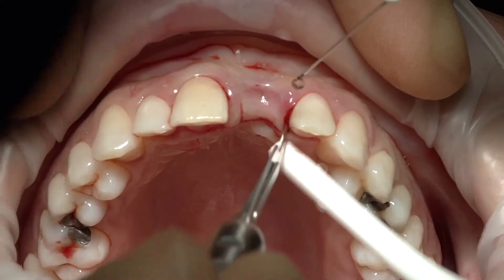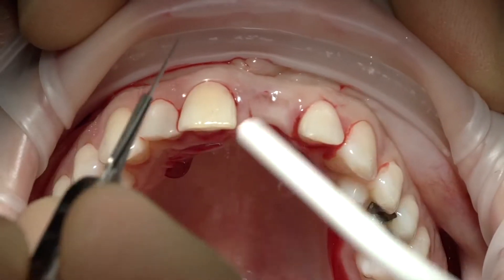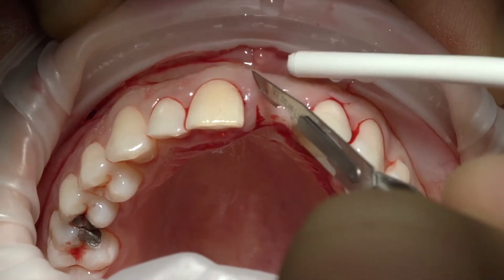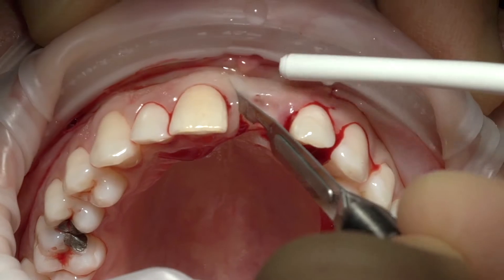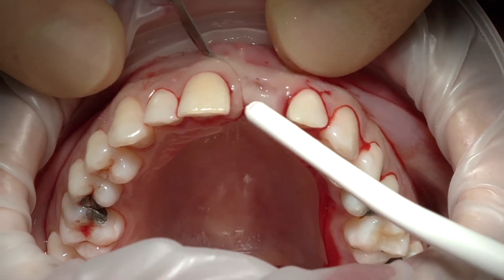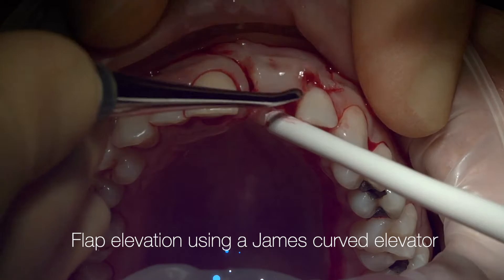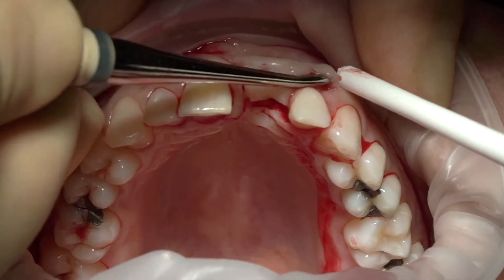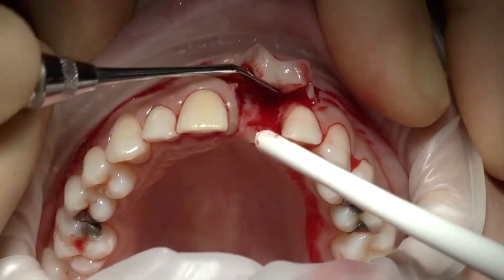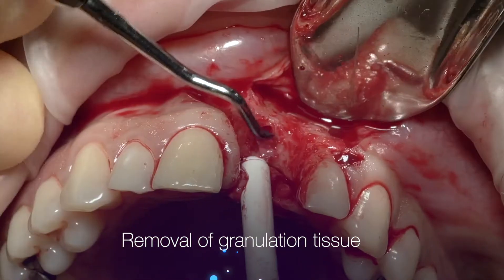Here we're going to elevate the papilla gently in this area — we're going to preserve the papilla and then go up there. Remember, we try to lean on the bone and elevate the papilla. Elevate the flap nicely, and every time you want to elevate, you literally lean on the bone and then elevate, with the sharp part around the bone and the polished side towards the soft tissue.